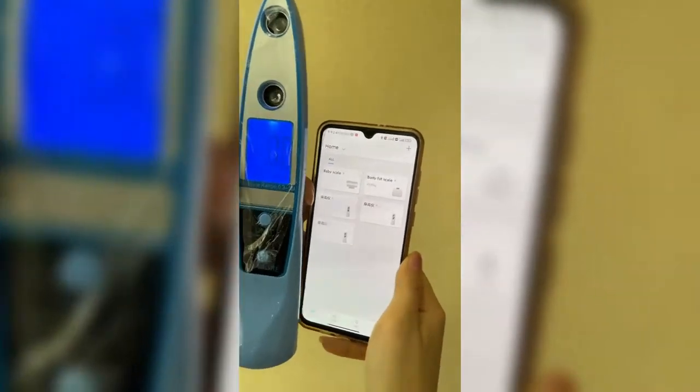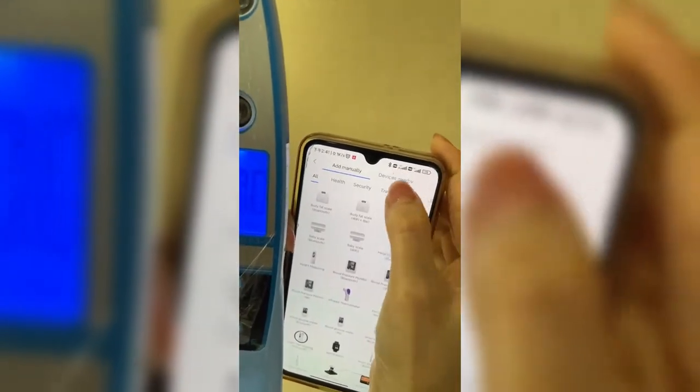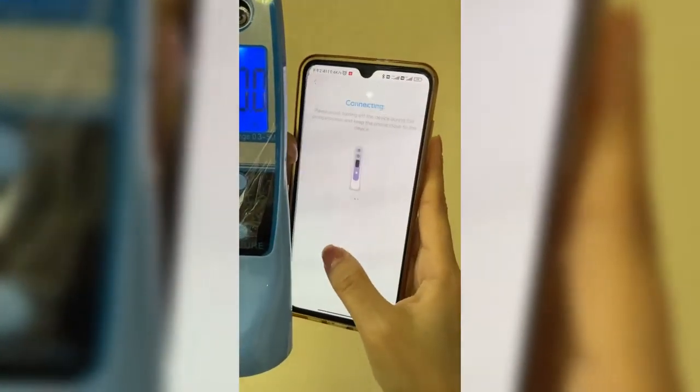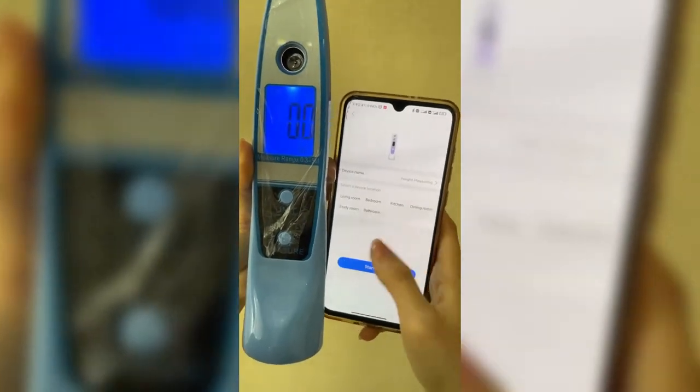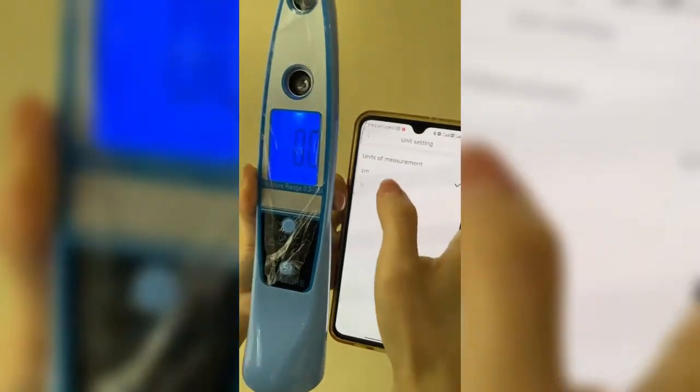Turn on the BY-802 and press this button to choose devices nearby, making sure the machine is turned on while connecting. Then here we choose the unit.